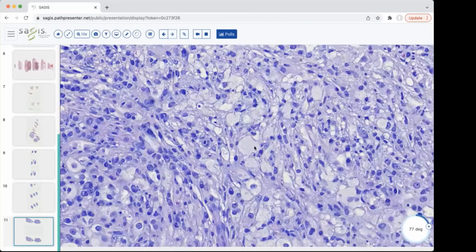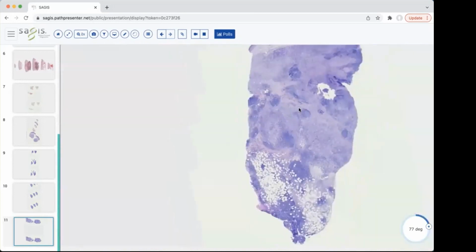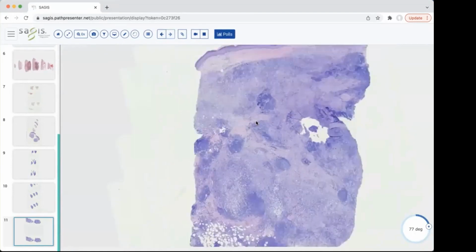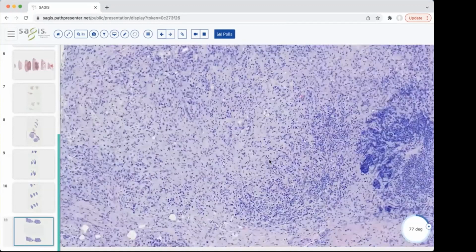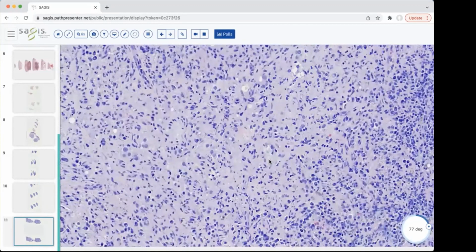Okay, I think we've seen a couple of examples. But this disease is called Rosai-Dorfman, also in the non-Langerhans cell histiocytosis family, but will often have the emperipolesis, and these tumor cells will be CD68 positive and S100 positive. That's something that you'll need to know going forward. But a nice example of that here.